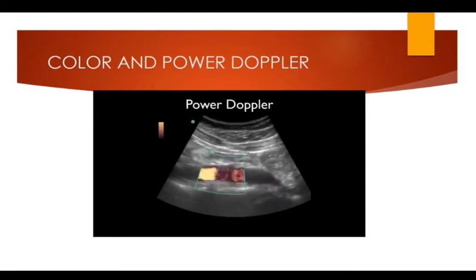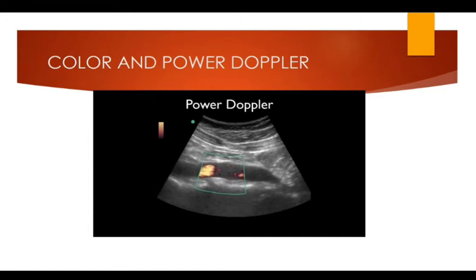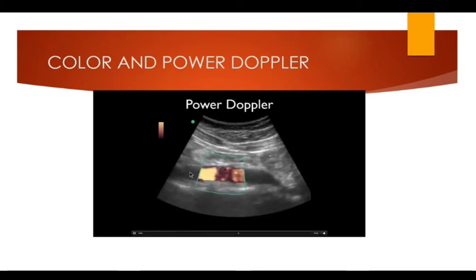Now power Doppler is a little bit more sensitive, is a way to think of that. It does not tell us whether it's going to or from. It's just essentially interpreting whether that sound wave has had any shift in its frequency, whether it be a higher frequency or a lower frequency. And so sometimes that's good in really low flow states. Now we're on the aorta and it's not a low flow state, but we're essentially parallel to the probe, right? So because we're parallel, we don't often get colors to show up because we can't interpret if it's coming to or away from the probe. So in this case, we aren't caring if it's coming to or away from the probe. We just wanted to see if it's color.